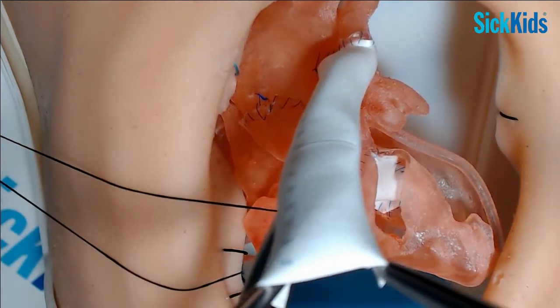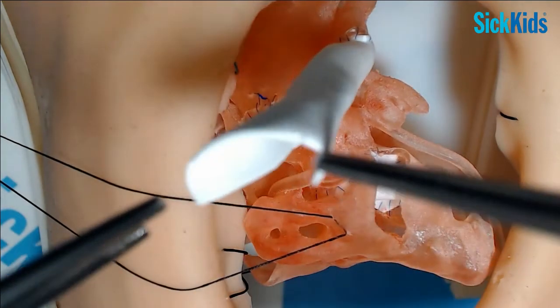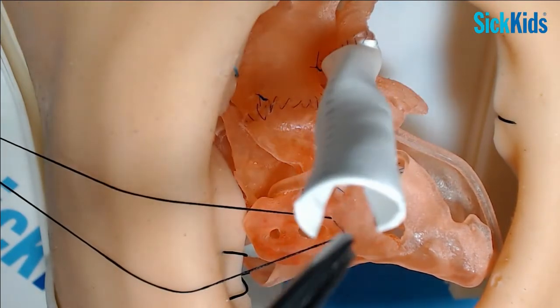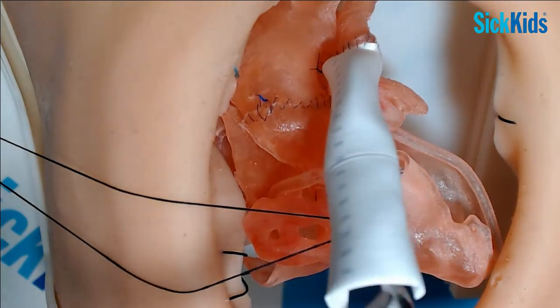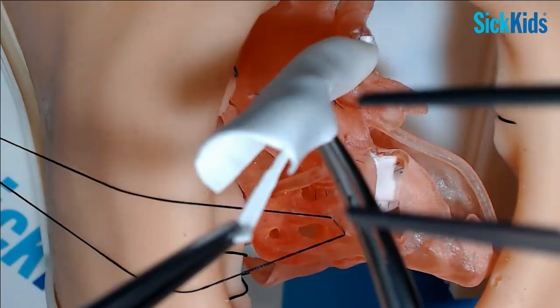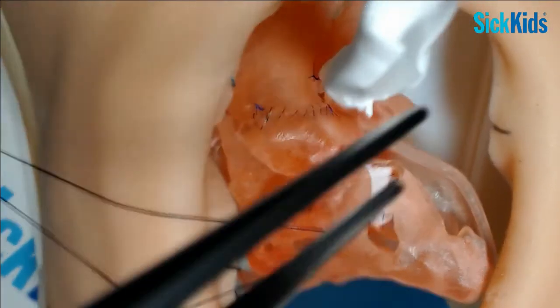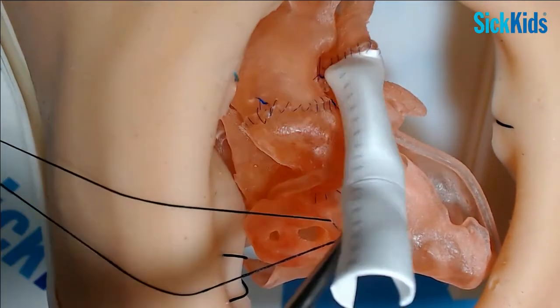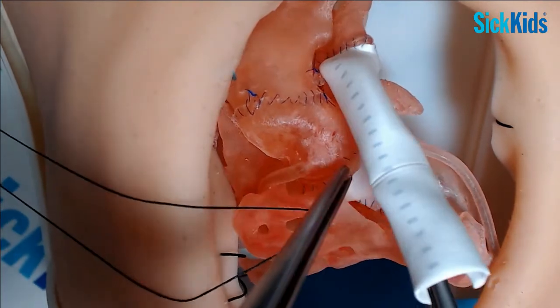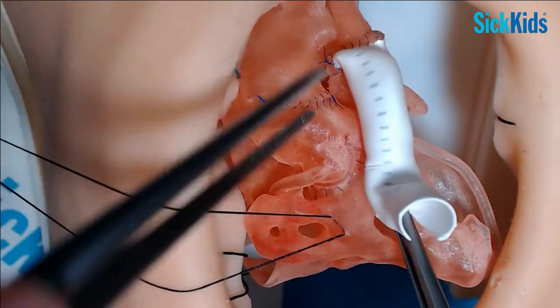Let's just hold it open. That's it. Okay. And again, you want it too long if anything at first. You have a look and see, but you've got to imagine the heart's going to fill up and they're going to pull back a little bit. So probably that's about right.